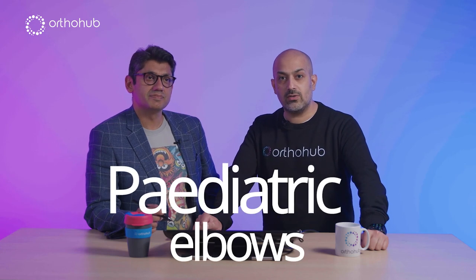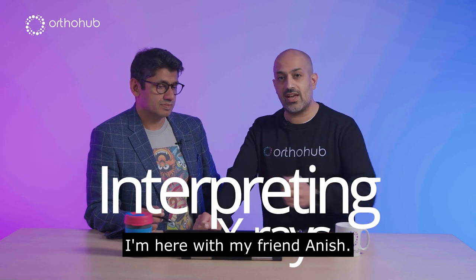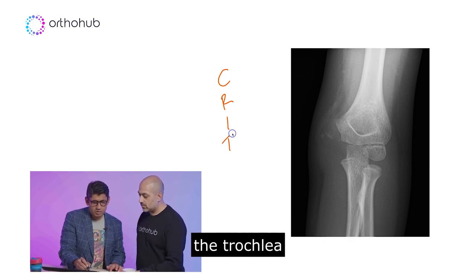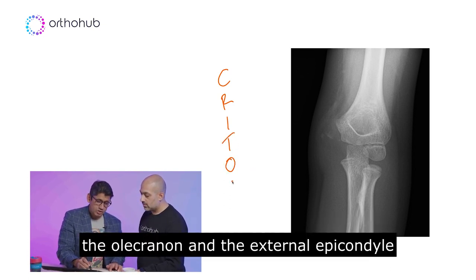Today we're talking about paediatric elbows and we're going to start off by talking about interpreting X-rays. I'm here with my friend Anish. You're going to look for the capitellum, the radial head, the internal epicondyle, the trochlear, the olecranon, and the external epicondyle.